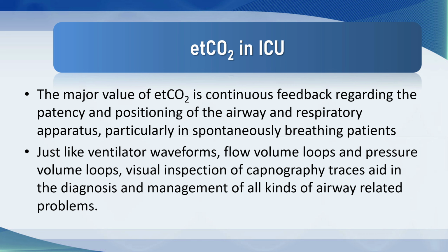The major value of end-tidal CO2 is continuous feedback regarding the patency and positioning of the airway, and particularly in spontaneously breathing patients. And just like other ventilator waveforms like flow volume loops and pressure volume curves, visual inspection of capnography traces aid in the diagnosis and management of all kinds of airway related problems. So it's something that you need to be looking at all the time, and it's something that I will emphasize continuously during this course. When you have information display, please look at it and try and see what's going on.